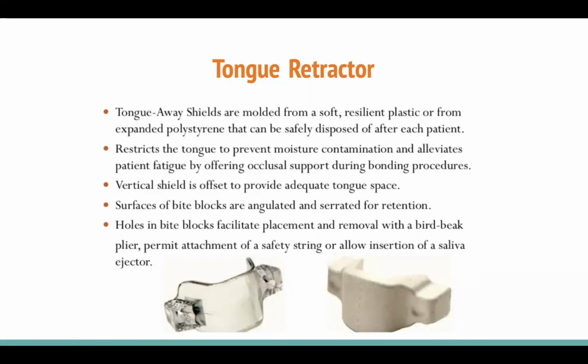My style is that I put the cotton rolls if I feel there is a lot of moisture. Otherwise, I put a suction in the right position and ask the patient to bite on the suction, so the patient's jaws are not tired during the bonding visit.